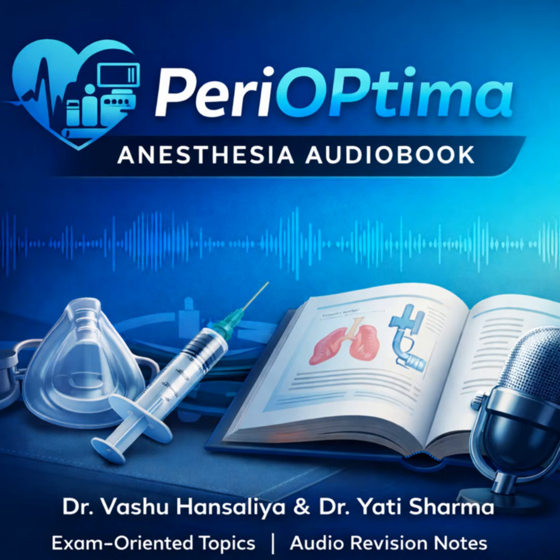Its purpose is life-saving. Rapid inflation of a collapsed reservoir bag, flushing the circuit in an emergency, or clearing out anesthetic agents. But with that high flow, there has to be a significant risk. Indeed, and the exam requires you to state this limitation. That high flow rate generates very high pressure.